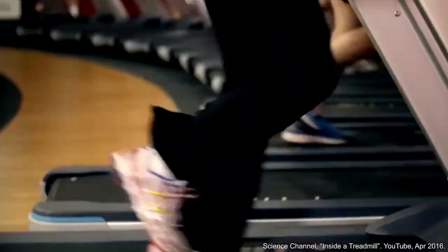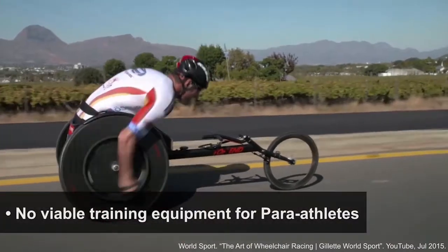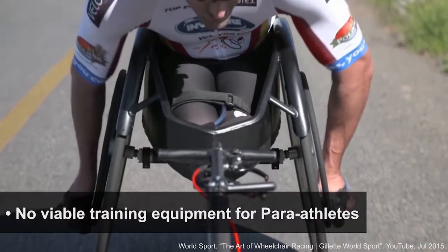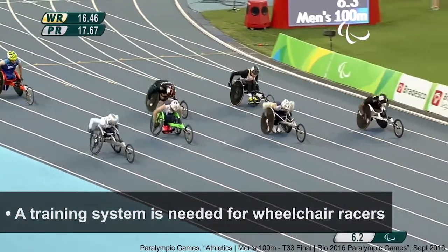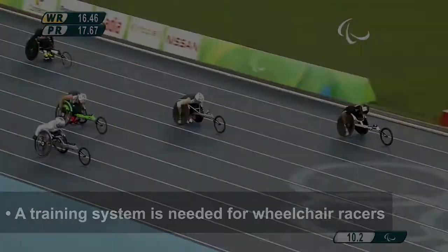Currently, there are a vast variety of training equipment for able-bodied athletes. However, there aren't as many commercially available training apparatus for Paralympic wheelchair racers. And in preparation for the Tokyo 2020 Paralympic Games, a training system is needed to aid with the wheelchair racers' performance.